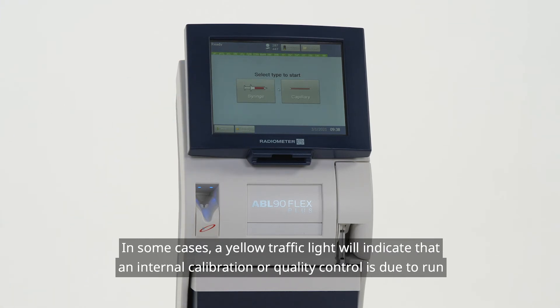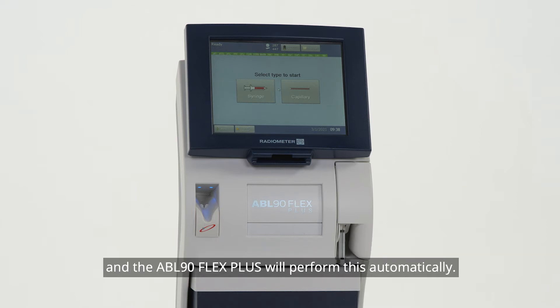In some cases, a yellow traffic light will indicate that an internal calibration or quality control is due to run, and the ABL90 FlexPlus will perform this automatically.